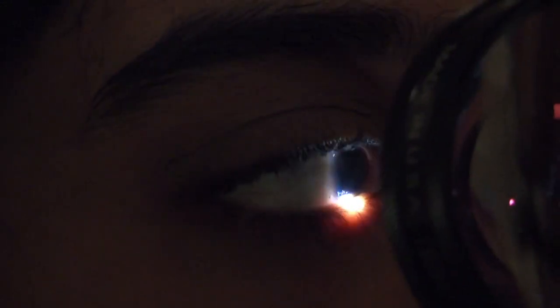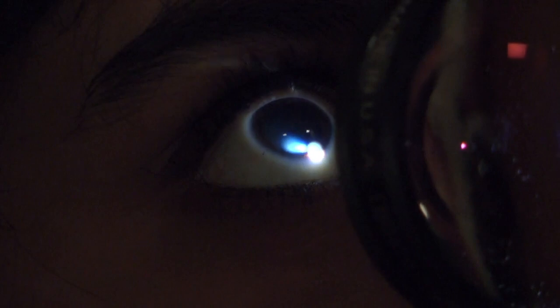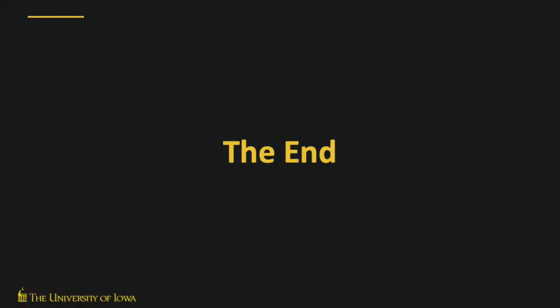The image you see is upside down and backwards. To orient yourself, think about the pupil as a window. When you ask the patient to look up, the window displays the superior part of the retina. This concludes the basic ophthalmic exam video.